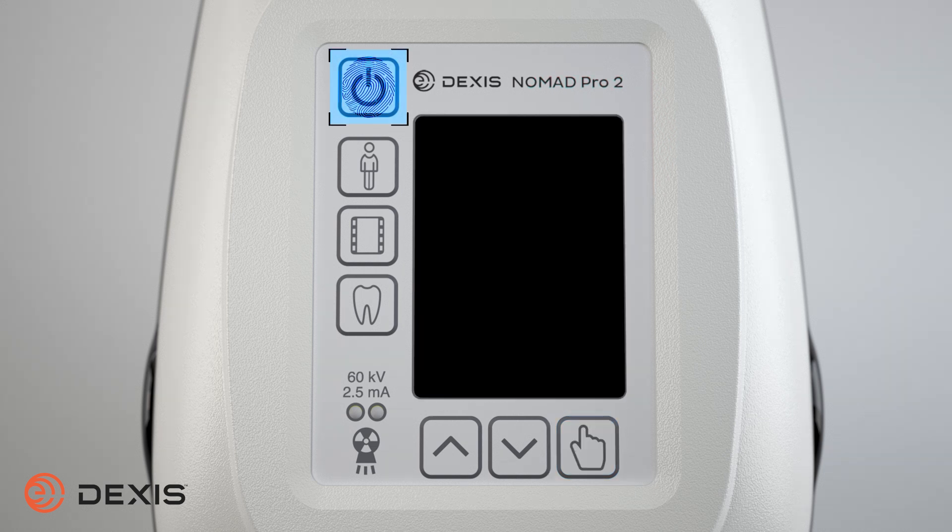To power off the Nomad, press and release the power button. The Nomad will automatically turn off after approximately 3 minutes of inactivity.